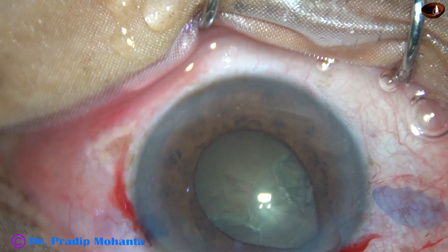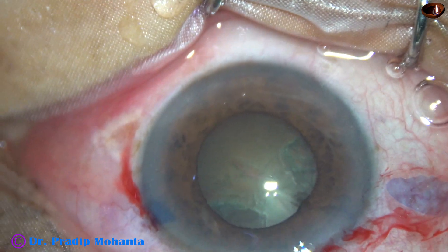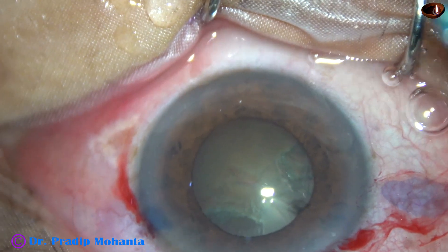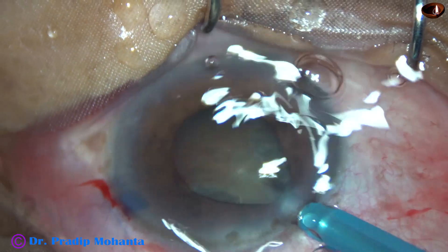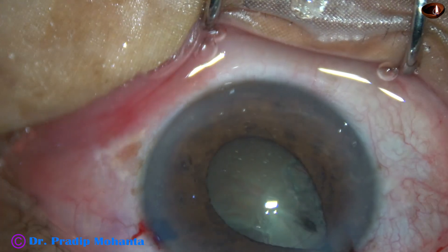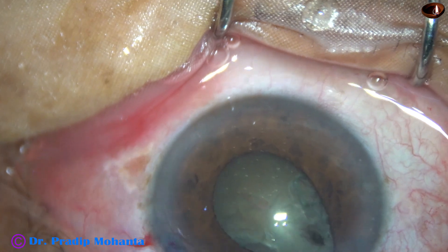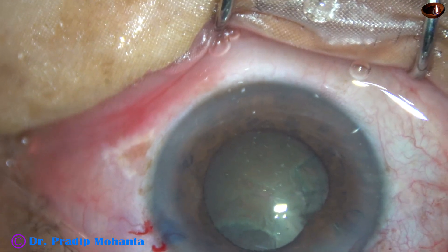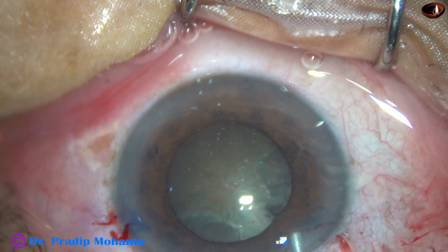I reposit the iris with a ball-tipped instrument. Now I try to introduce the tip of the phaconeedle. Immediately, iris prolapses through the main wound, and the eyeball is hard. Immediately, I decide to apply iris hooks.